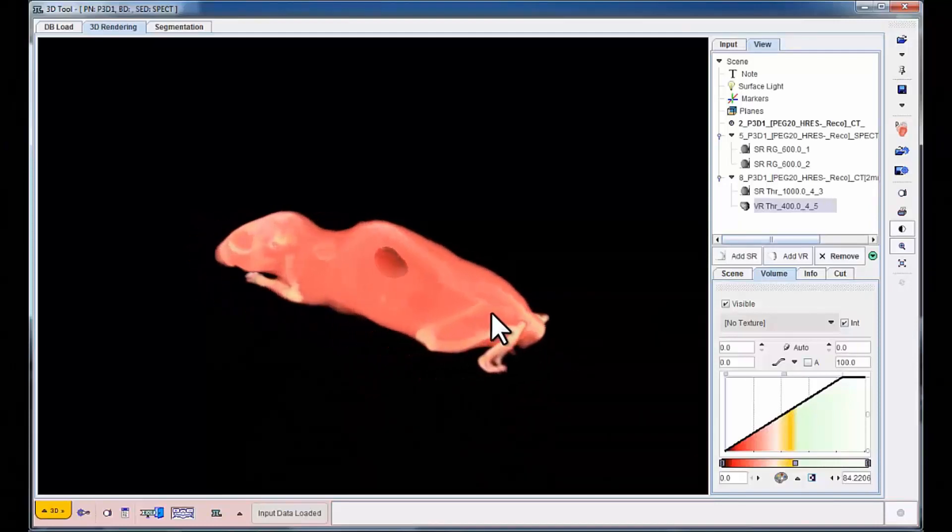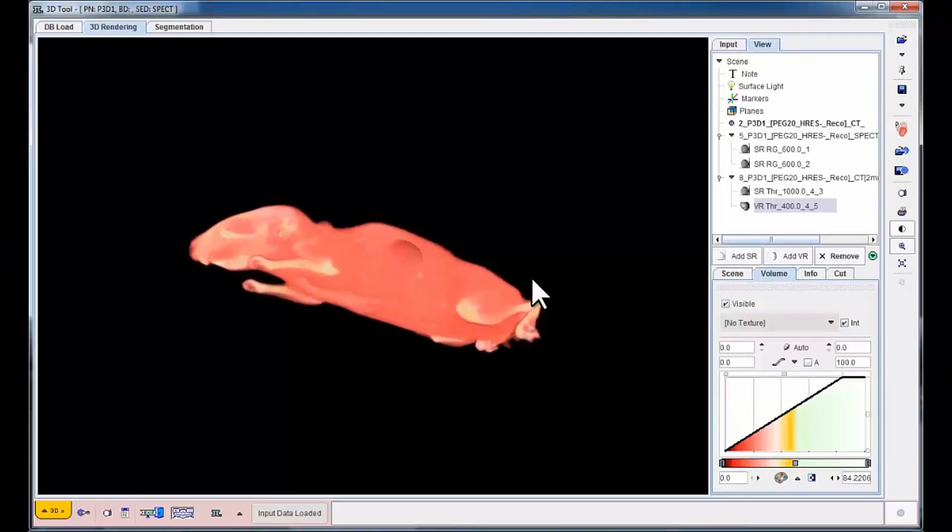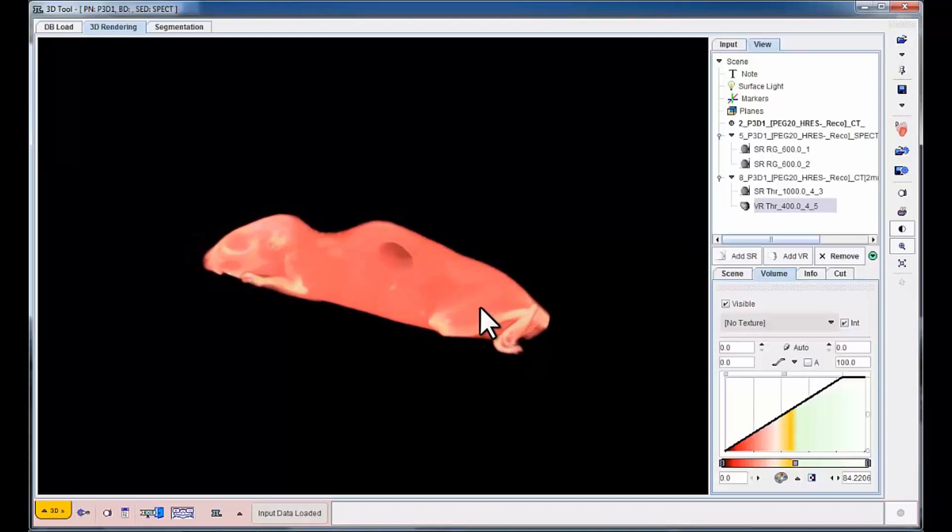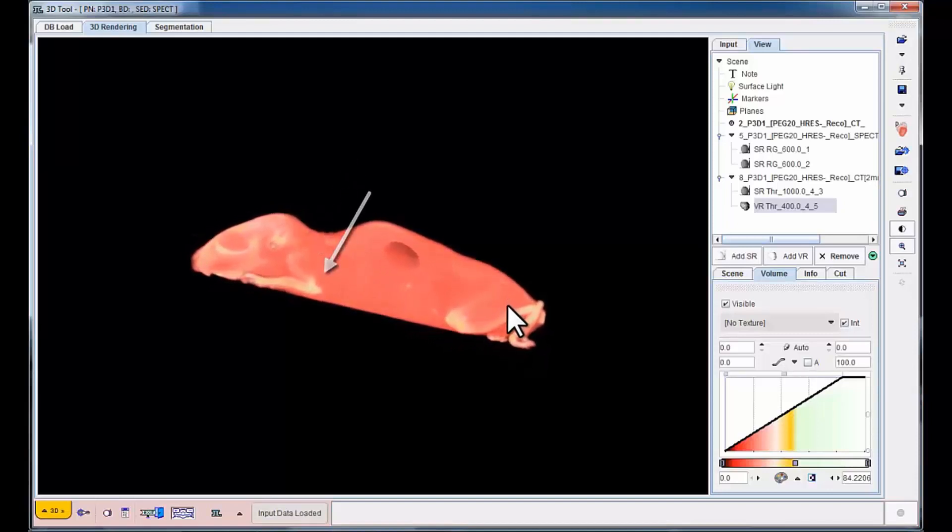When rotating the scene, the tumor mass on the upper back becomes clearly visible.